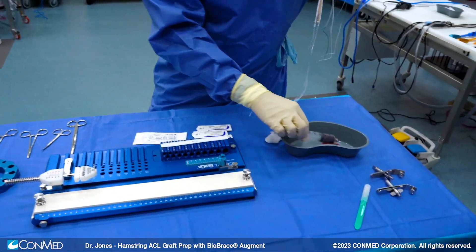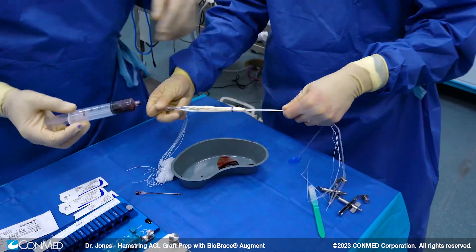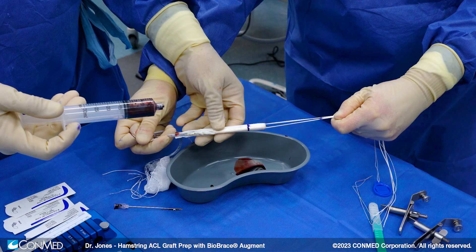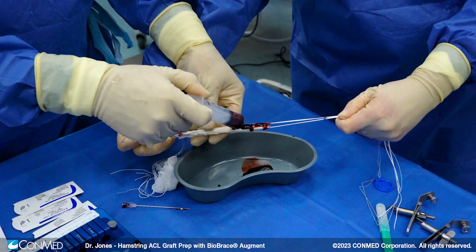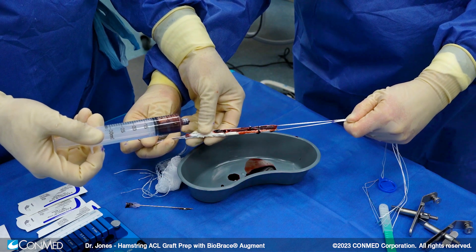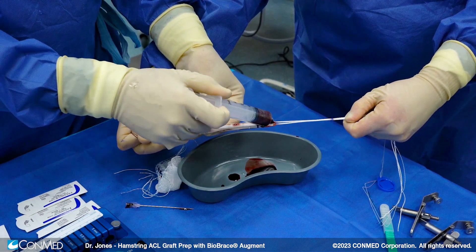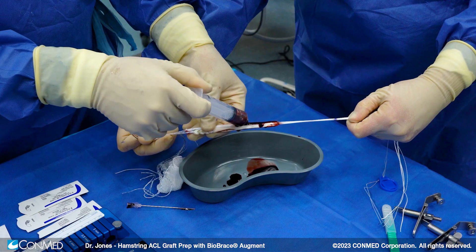One technique is to take advantage of the biologic capabilities of the collagen type 1 within the biobrace by placing blood directly on it. Here's the biobrace — you'd obviously want to demarcate the sites of graft and button passage prior to placement of the blood, because the blood will block your ability to see those marks when passing the graft. We simply drip it on the biobrace and you see how it soaks up that blood quickly. I've been amazed at how this strong construct has this biologic capability to soak blood immediately. We're really going to take advantage of the healing potential and, importantly, the load sharing of the biobrace while this graft incorporates in the patient.